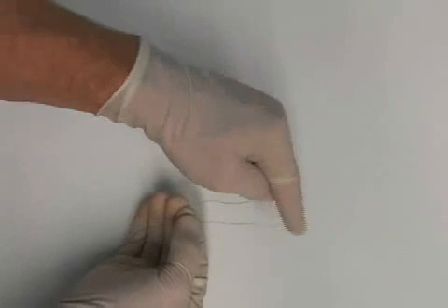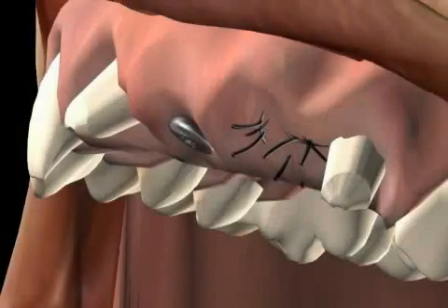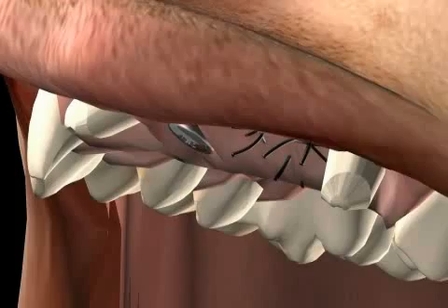In the film, you see that vicryl is flexible. By comparison, the other thread is inflexible. Such threads that can poke the mouth are often considered uncomfortable.